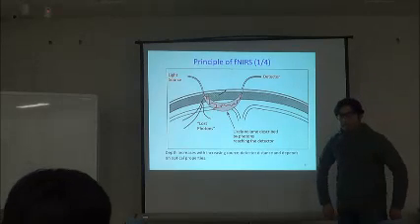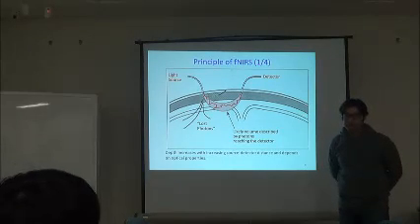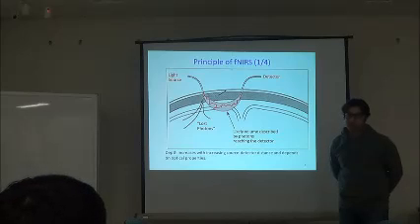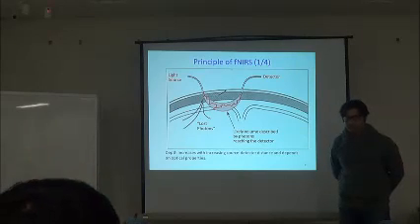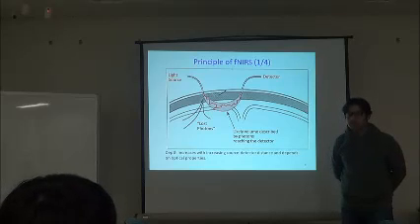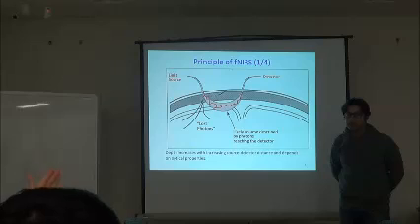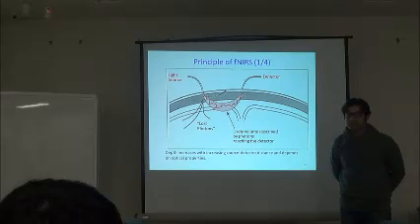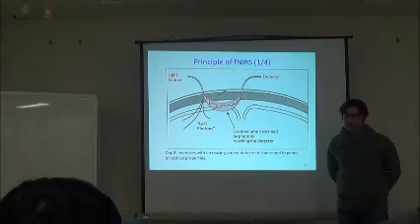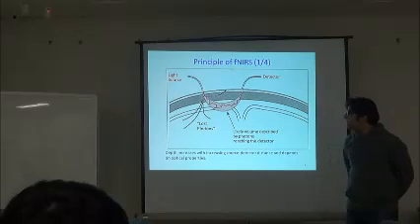To emit any light, you need some electronic power, like voltage or current. If we increase the power, can we make stronger light, stronger photons, so that it can penetrate more depth or be more sensitive?